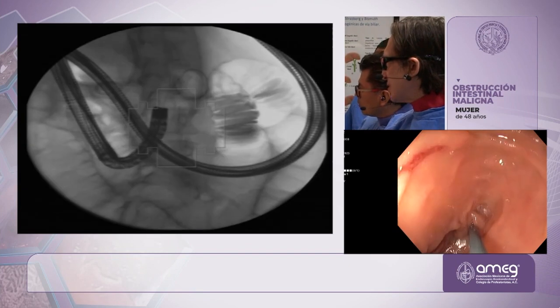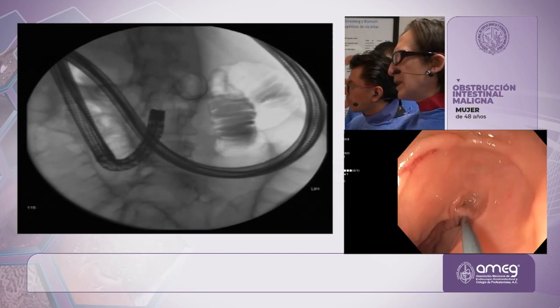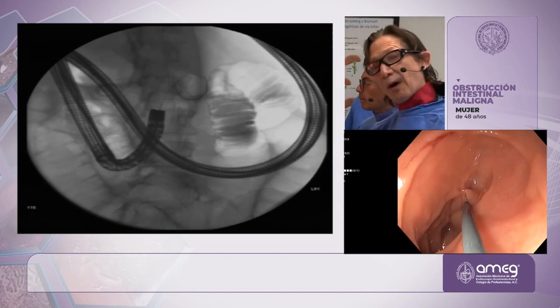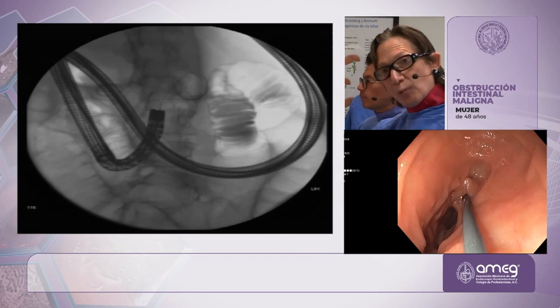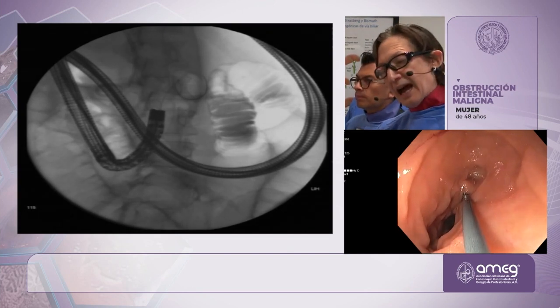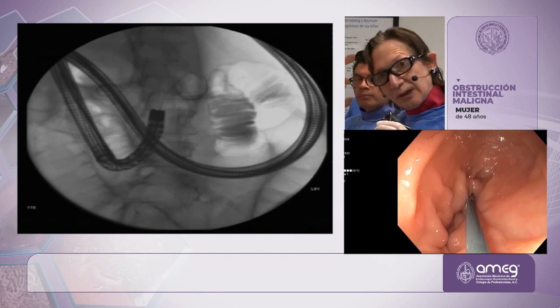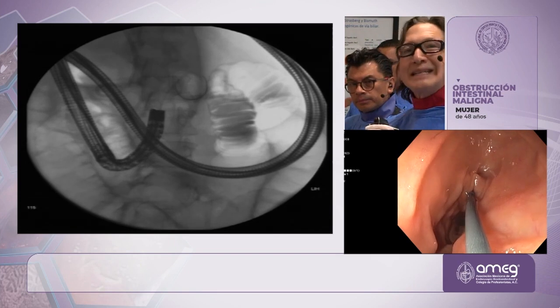All right, well, let's not waste too much time. Let's just leave it there. It's going to be fine. Okay. Let it coil. What's really important, and we don't need to keep our foot on the fluoro pedal the entire time. I'm going to leave the guide wire in place, make sure the guide wire doesn't come back, and I'm going to exchange the delivery catheter that I used here for the oral enteric catheter.